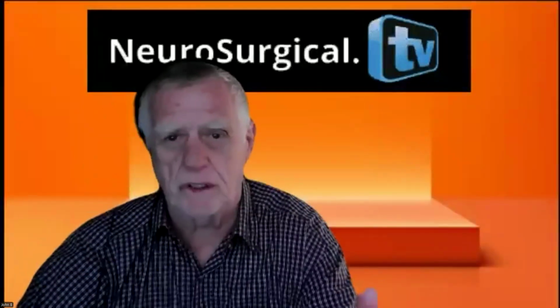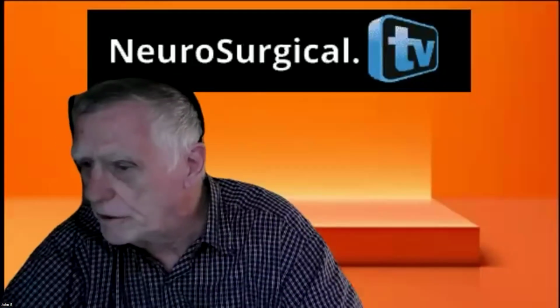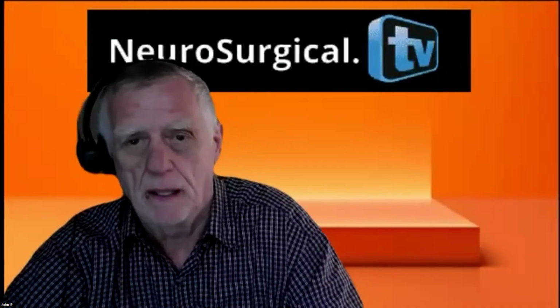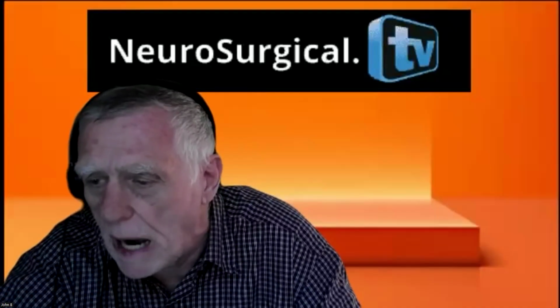Excuse me, we have one more question, Professor, from Fitri. Fitri asked, how do you manage if a rupture happens when you're coiling? If you postpone, how many hours or days to treat it? Or do you switch to open surgery? In the angio suite, the neurosurgeon comes and places pressure, and very quickly goes to surgery when there is a rupture with the coil.